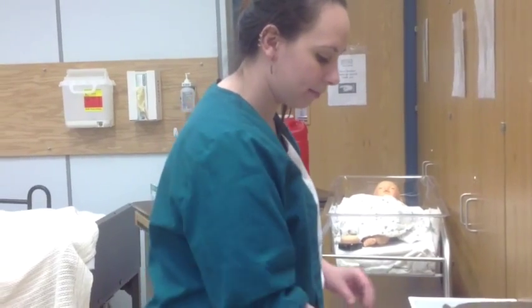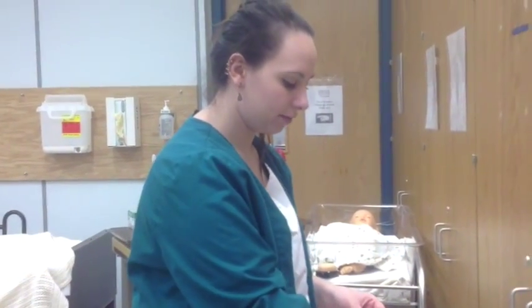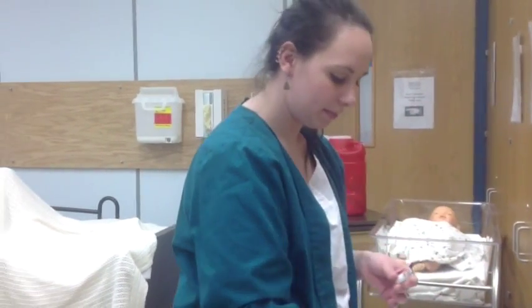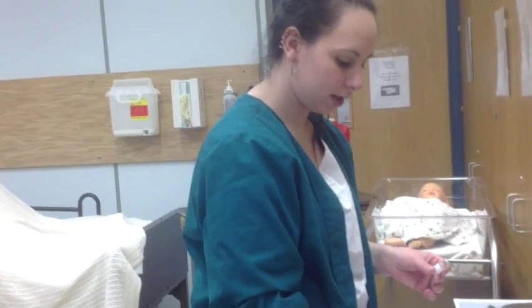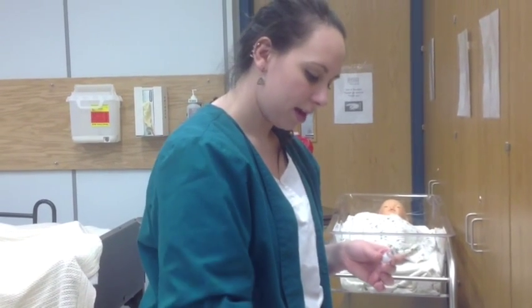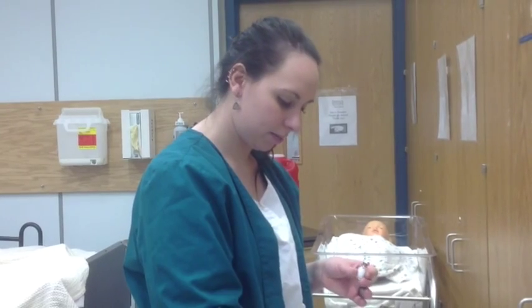So now I'm going to do my second check where I double check the medication again. So you do it before you pull it out and once you have it out. So you go through it again. Right patient, Baby Charles, born today. 11 a.m. is when he needs a shot. You want to go through and make sure that you have right drug, right dose, right route, right reason. This is a vaccine, so the reason is to help protect them. You also want to make sure that you have the right time, which we did.